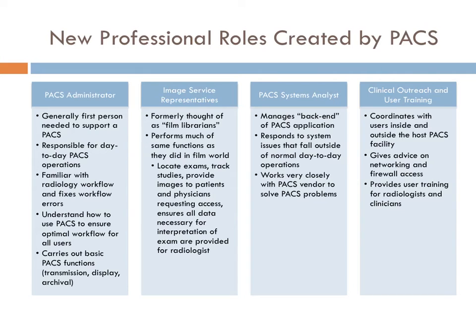They often understand how to use PACS to ensure the workflow for users is optimal, so they are extremely helpful to you when PACS is implemented. They carry out basic PACS functions, so they help with PACS image transmission, display, archival, that type of thing.